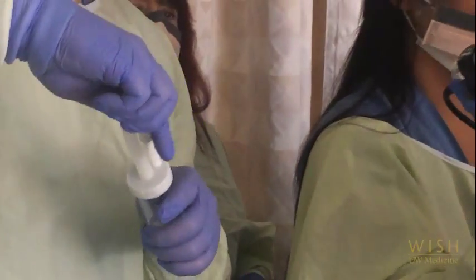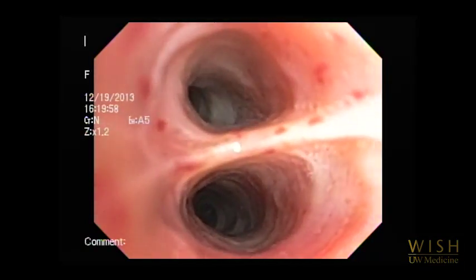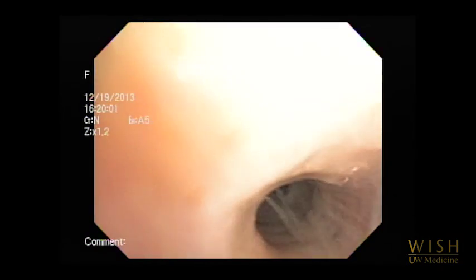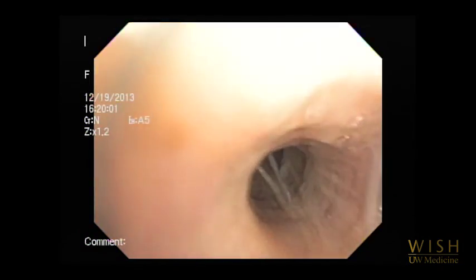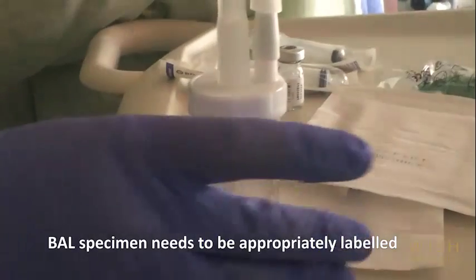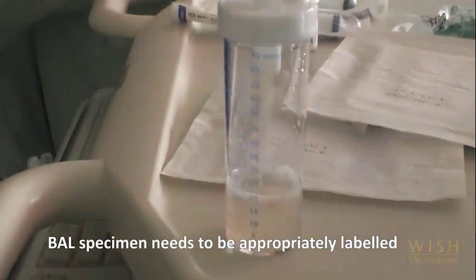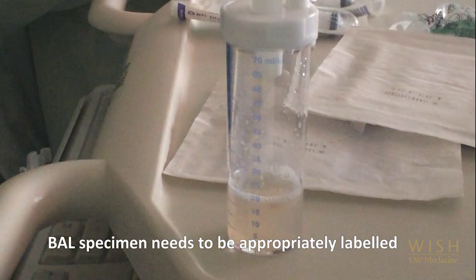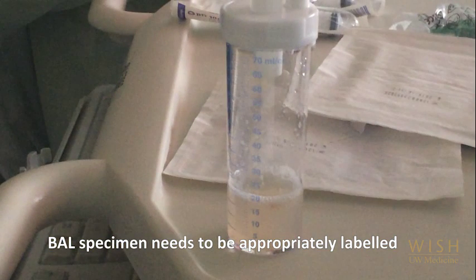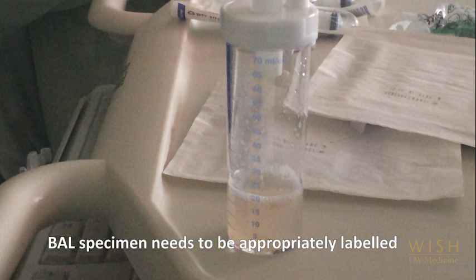Once the BAL is completed, the bronchoscope can be withdrawn or redirected. The collected sample is properly labeled and transported to the laboratory for analysis. It is unnecessary to routinely obtain a post-bronchoscopy radiograph unless there is a clinical indication.